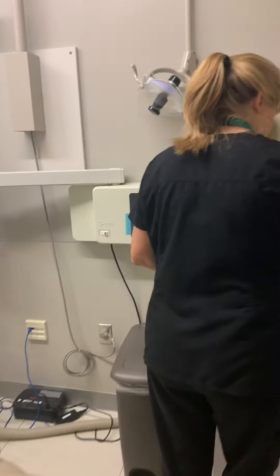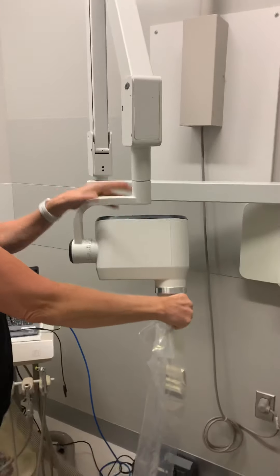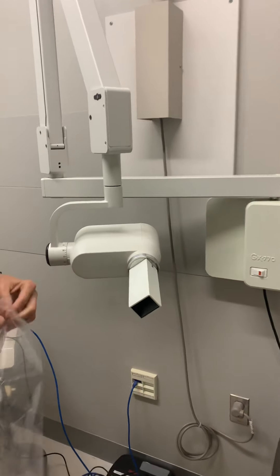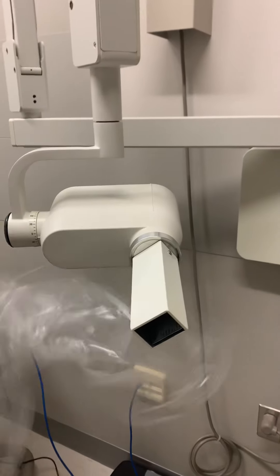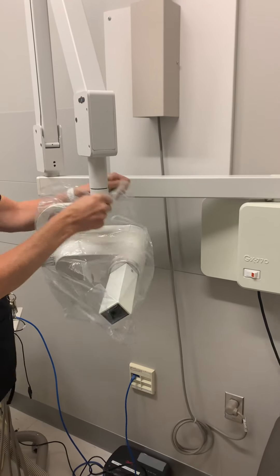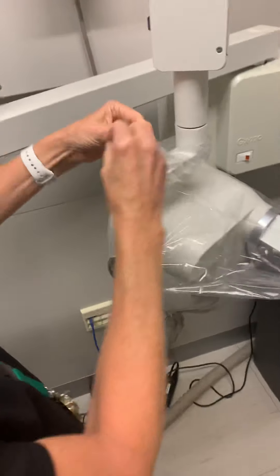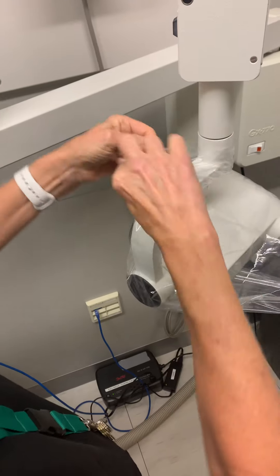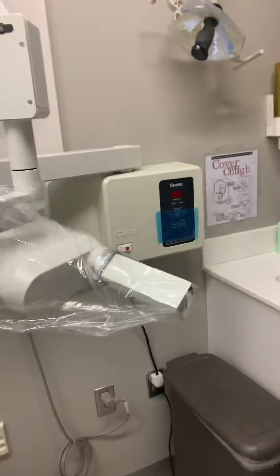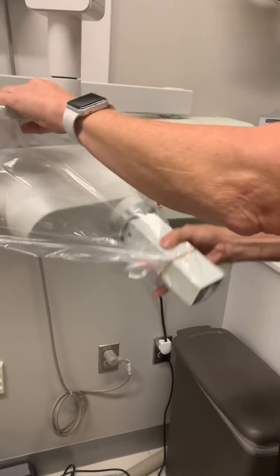Now in the room, we're going to put on our cover for the PID. This is going to go over the whole head of the PID here — it goes over top. Then you're going to twist and try to tie it as best as you can. And then she's going to put a rubber band over the end so that the bag stays on a little bit better. That helps when you're taking x-rays.